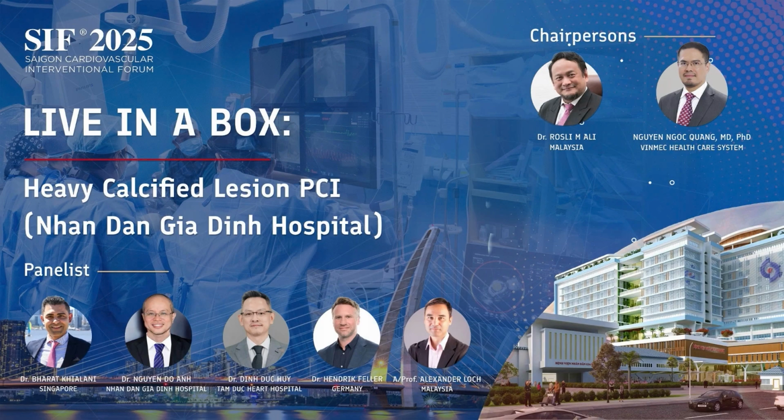Dr. Hui first. Yeah, I think it looks a bit scary on angio, but anyway, for me, I will wait maybe 10 minutes more in the cath lab, leave the patient there, and then recheck by another shot after 10 minutes. If the flow is good, and we don't see any hemodynamic change, then I think we can stop the procedure.